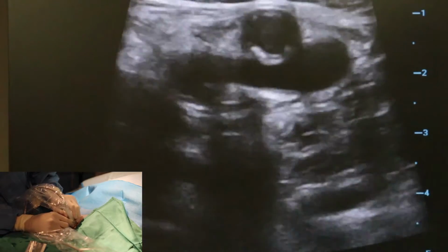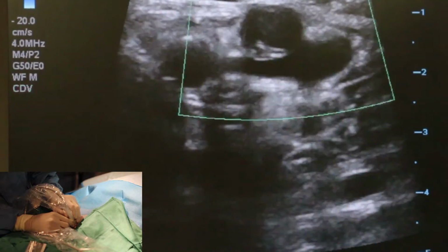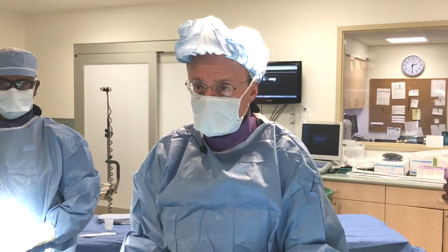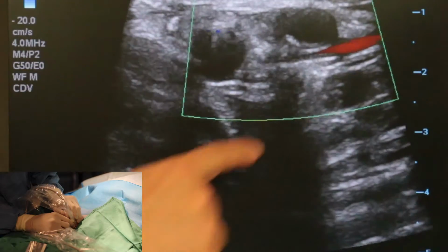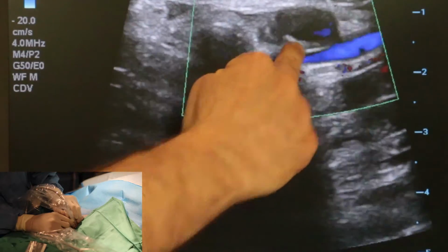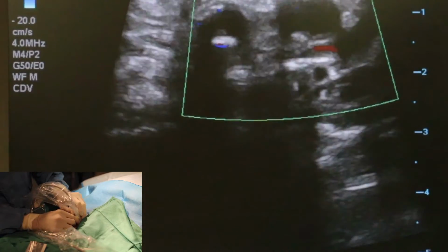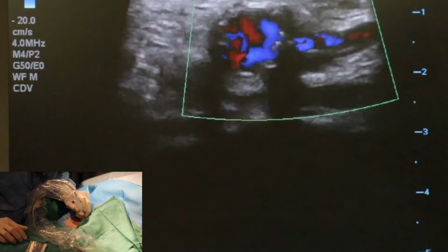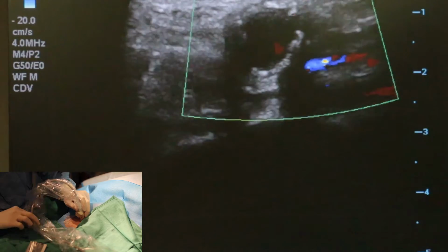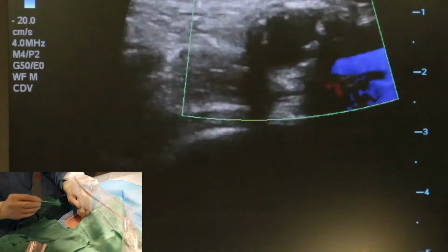If you could turn on the color, we can see that even a little bit better. There's the color signals. The vein below, which I can compress. And actually that's the bifurcation of the artery. If I go up a little bit more towards the patient's head, you'll see those two vessels become one, and that shows we're right above the bifurcation. That's the best area to stick the artery, right above the bifurcation.